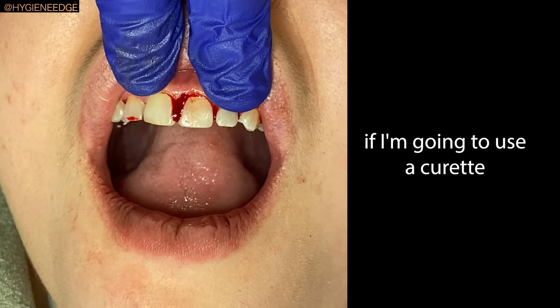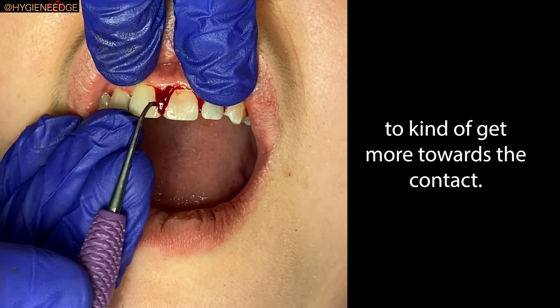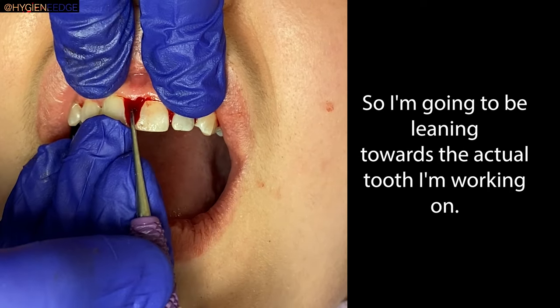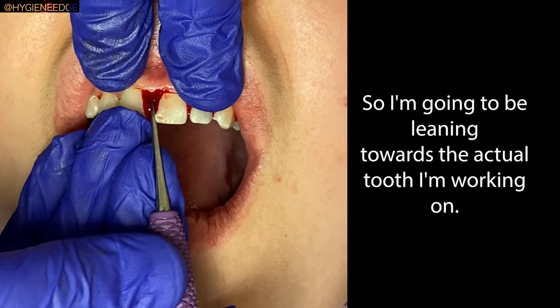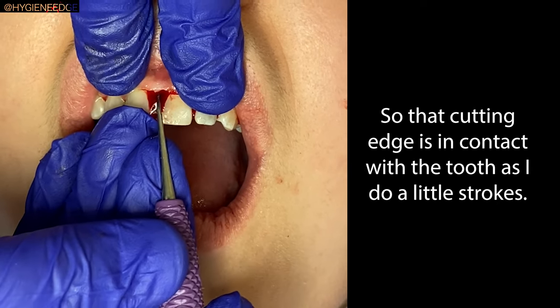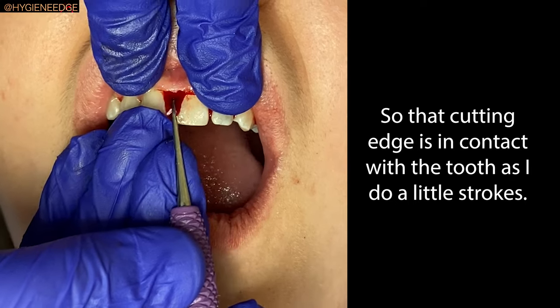If I'm going to use a curette to get more towards the contact, I'm definitely going to have to make that 70-degree angle. So now I'm going to be leaning towards the actual tooth I'm working on, so that cutting edge is in contact with the tooth as I do removal strokes.